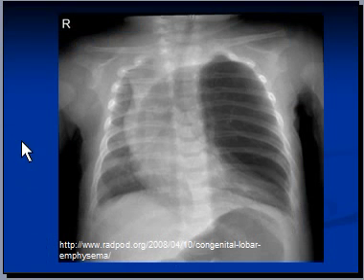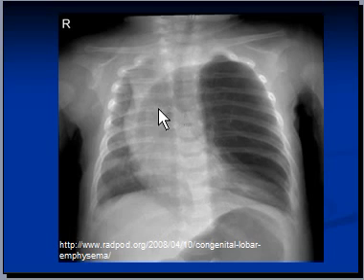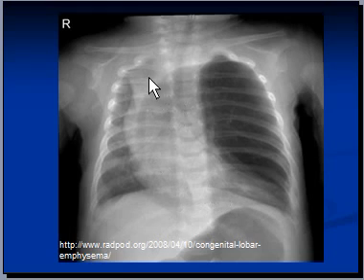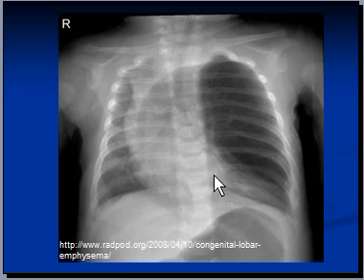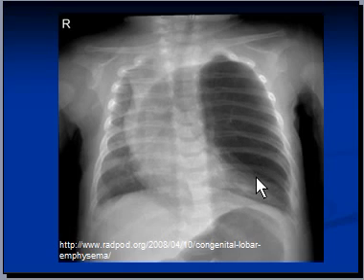The second X-ray, however, is clearly abnormal. There is a radiolucent shadow arising from the left hemithorax, projected over the midline and extending into the right hemithorax, also causing mediastinal shift to the right. The heart is probably somewhere here. Notice the left lung is clearly darker than the right lung.